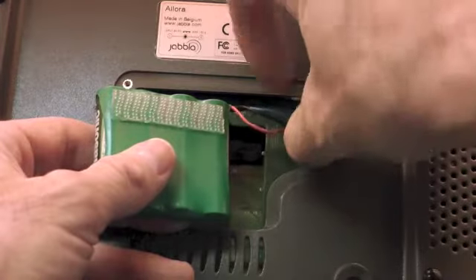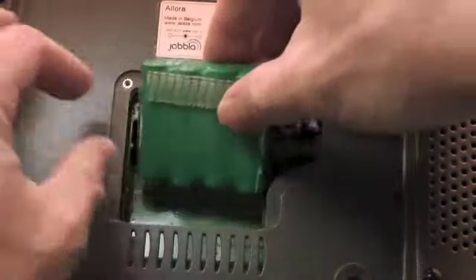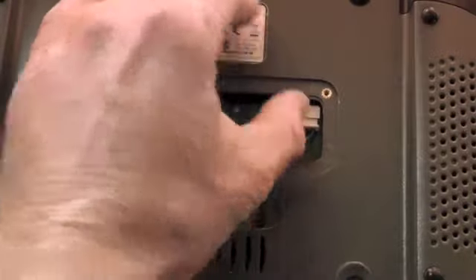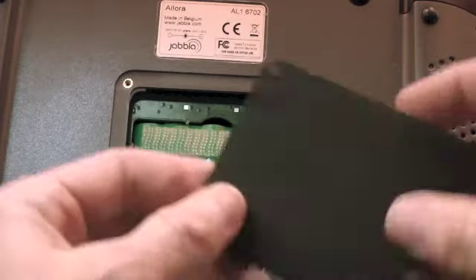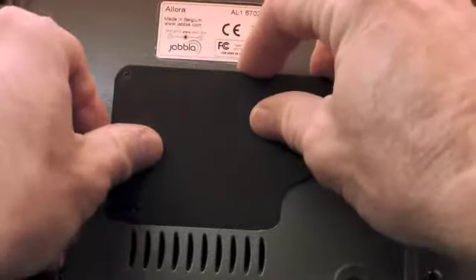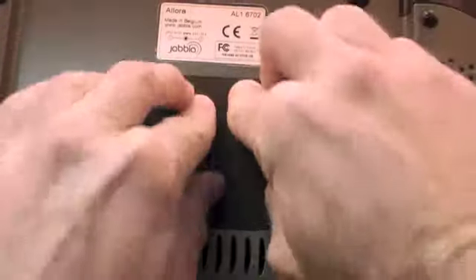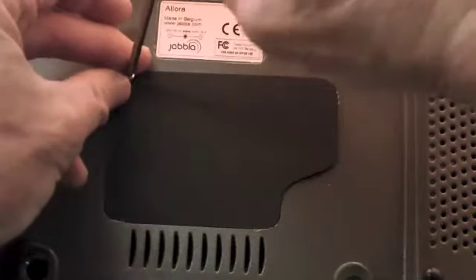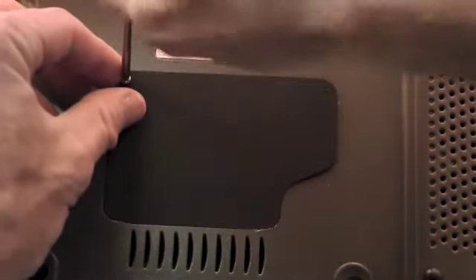There's only one way the battery cable can be inserted into the connector. Insert the new battery in the bottom enclosure, making sure the wires are inside the device. Reinsert the battery cover, making sure you're putting the bottom inside the device. Using the Phillips head screwdriver, reinstall the 2 battery cover screws.